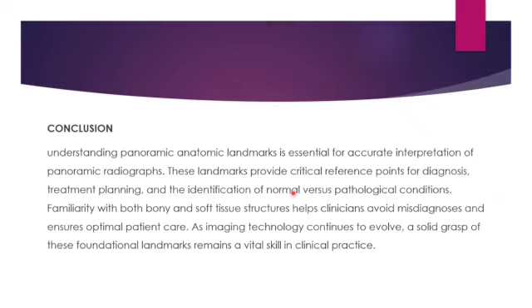And as imaging technology continues to evolve, a solid grasp of these foundational landmarks remains a vital skill in clinical practice.